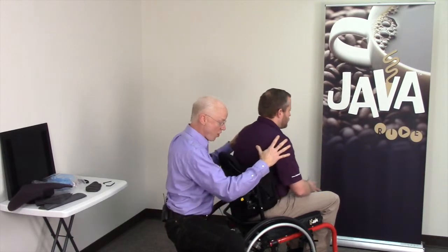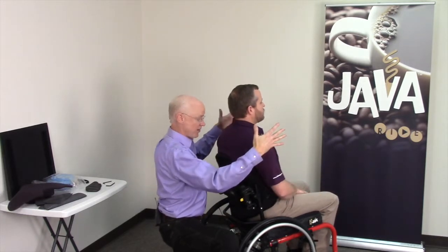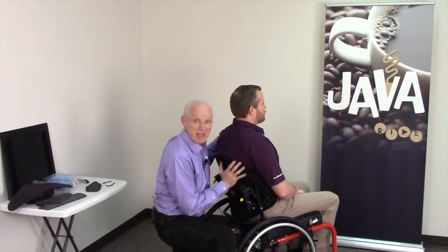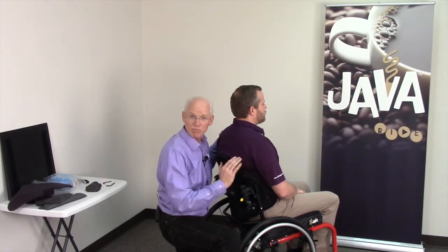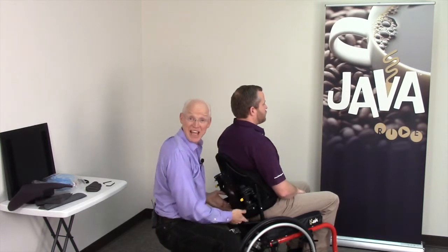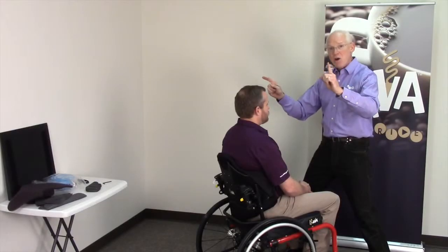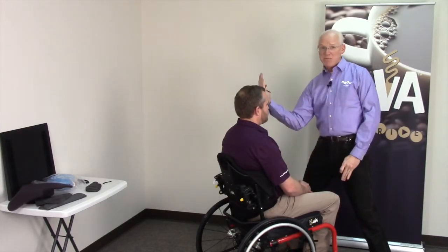Ryan can now lean forward, scoot his hips back in, that last little bit. There we go. All right. Now I've got really nice contour. I'm able to bring that back shell up and give nice weight-bearing support through the trunk. So I've done depth, I did my height, I did my back angle, I bent my stays. I should be done. Now we've got them on the chair, foot support correct, back support correct.